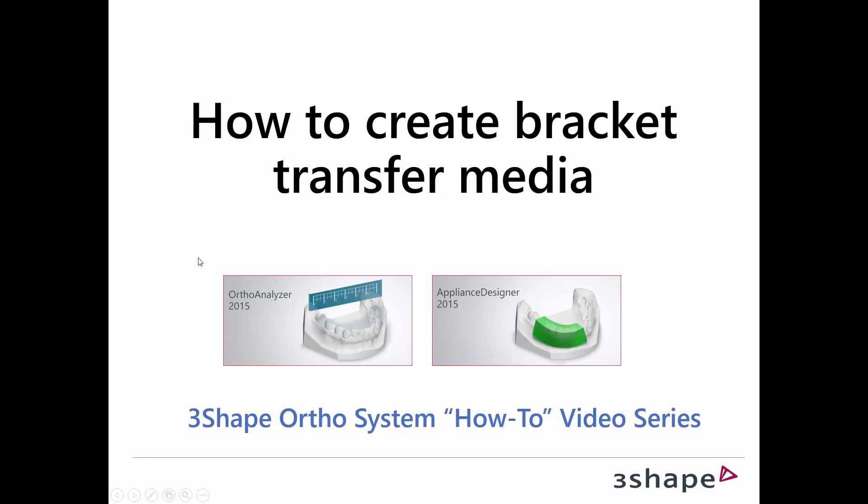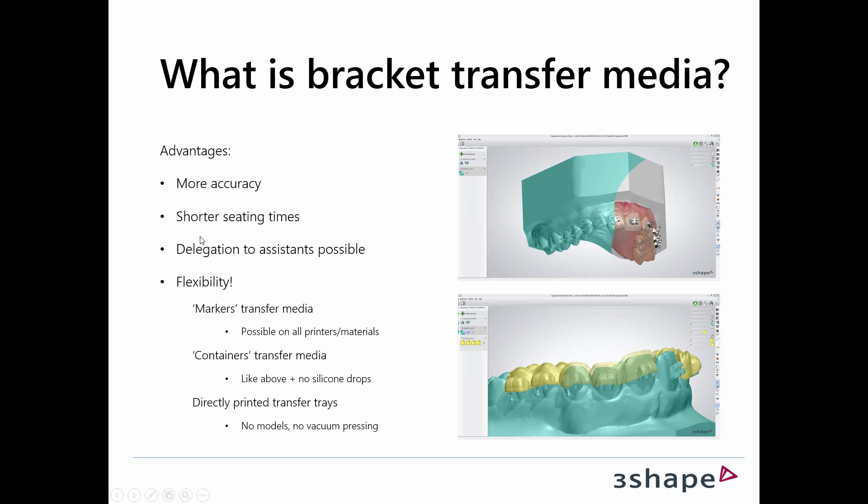Welcome to this how-to create bracket transfer media training video. My name is Hendrik and I'm joined by my colleague Tim. What is bracket transfer media exactly? When we look at bracket treatments in the old days, you would see the brackets one after one directly in the patient's mouth.